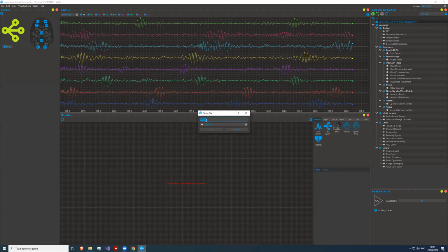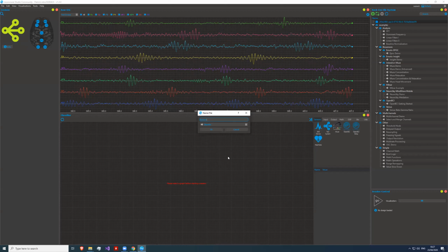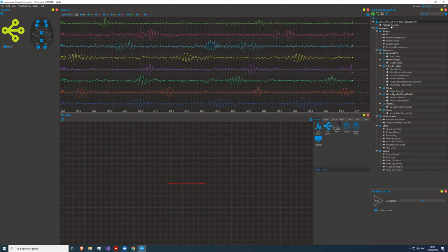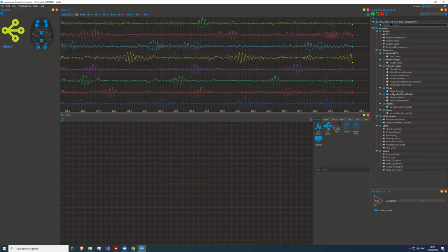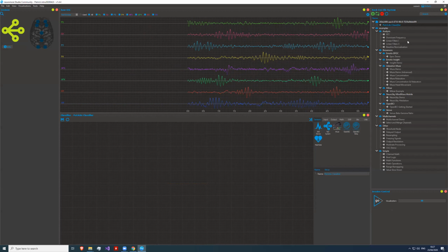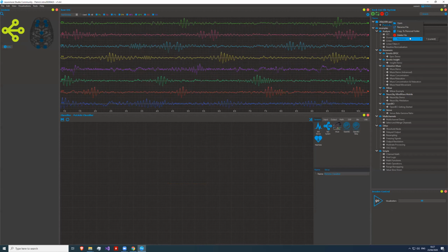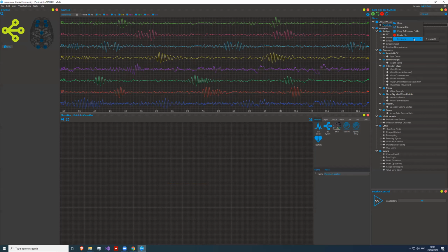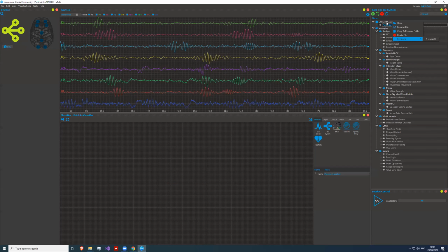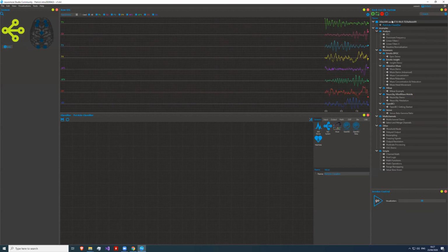We call it Patrick's classifier. And then we can open it. One neat thing about that backend file system is that we do versioning with all those files. So it's like with GitHub, like a source code versioning repository. We also do that with all the revisions that you do. You also can create folders in here, and I guess for the sake of today, that's sufficient.